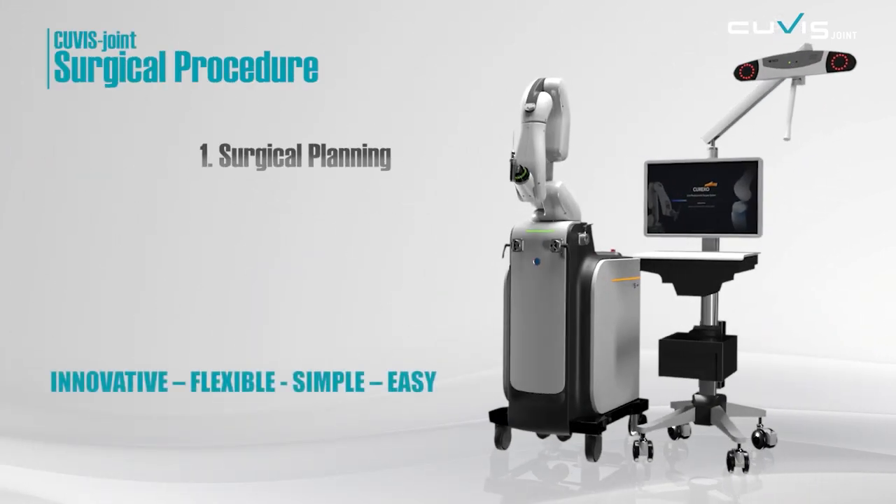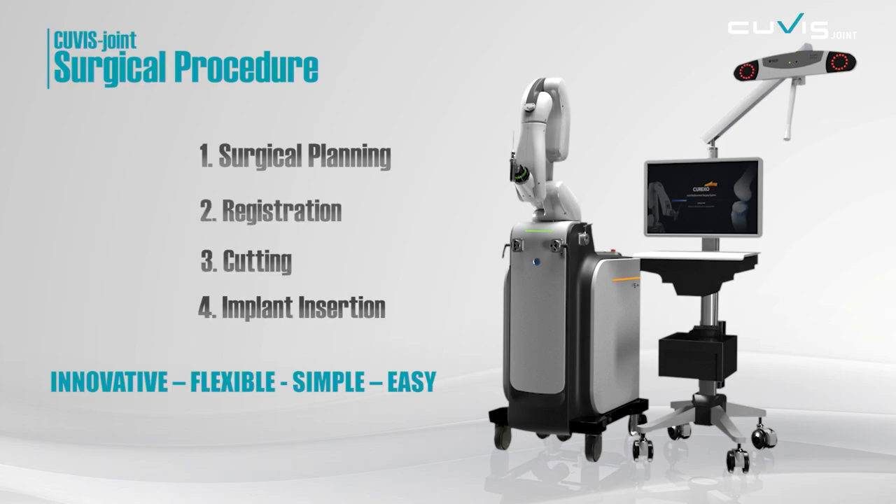The QVIS Joint procedure starts with a surgical plan establishment. After matching the CT data with the actual patient information, the robot automatically cuts the bone and then the implant is inserted.